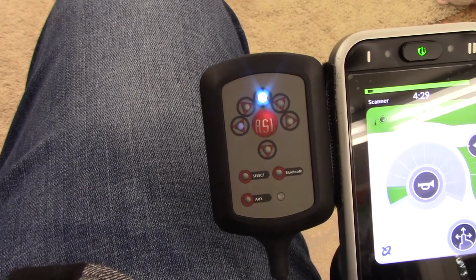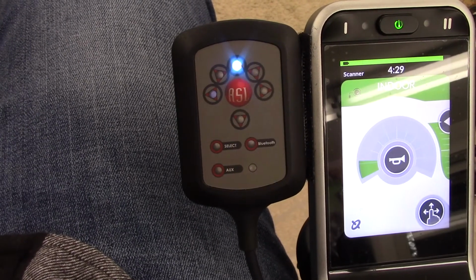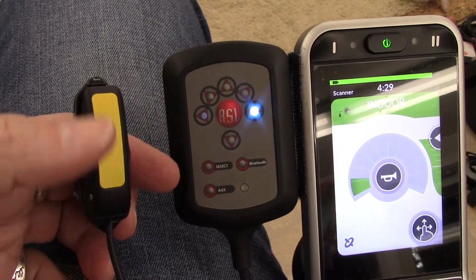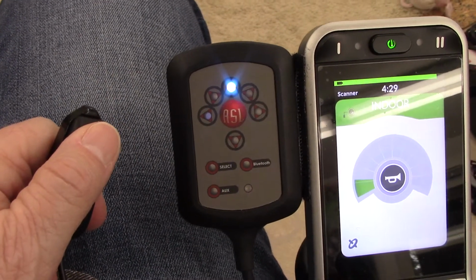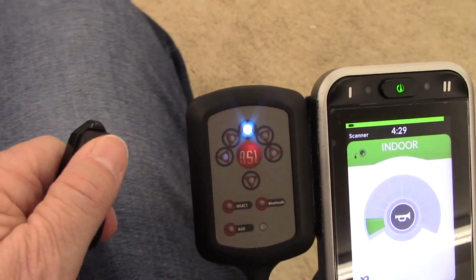Okay, here we are in the chair, and that's the display. And you can see how quickly the light's moving. So I am going to take this switch, and I'm going to press and hold it when it gets to forward. And I'm going to move. Okay, you can kind of see moving.